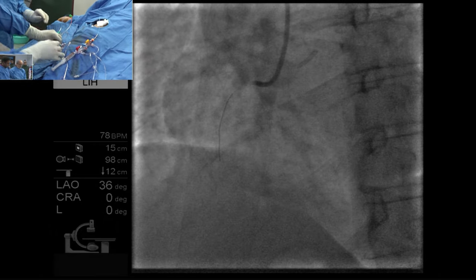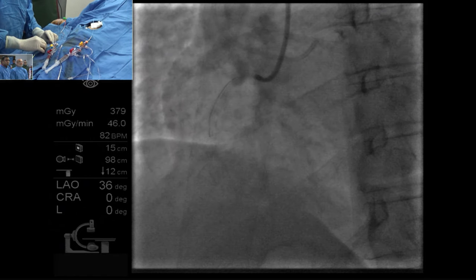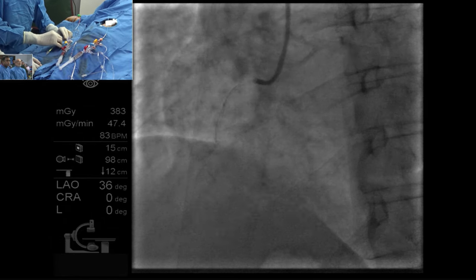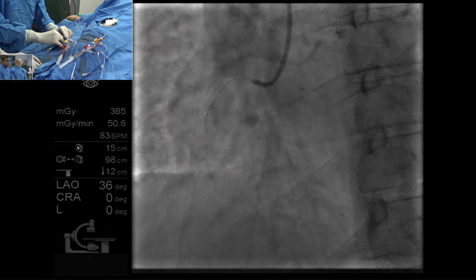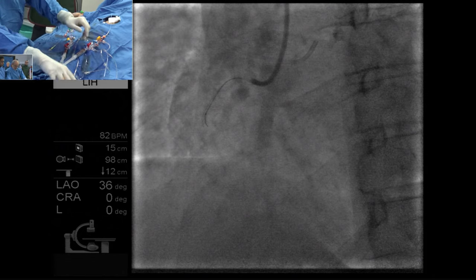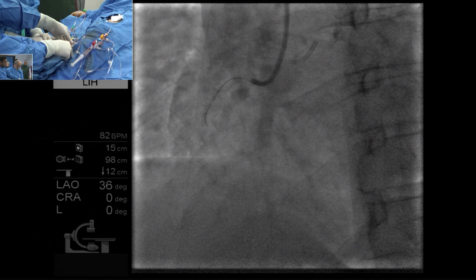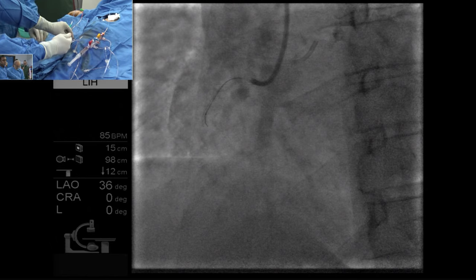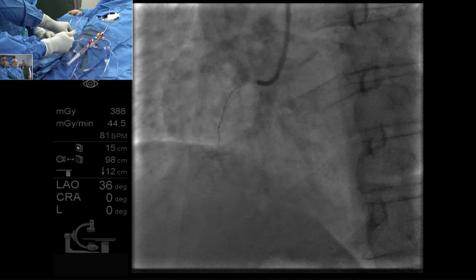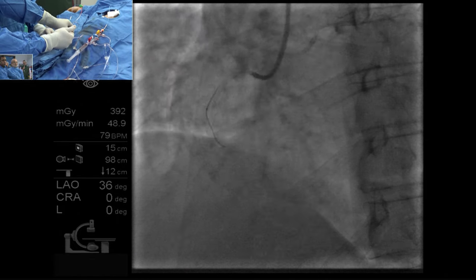Yeah. The Pilot 150 is not good here. There is total occlusion in the distal part. And also it would have been a good idea to have a microcatheter. Yes, microcatheter. So it would be easier to change the wires. Yes, we can change the wire. The Fielder XT, I think, would be a good wire, but my worry would be whether you'd be able to cross the distal cap. That looks very calcified, and I'm not convinced that there's a microchannel distally.